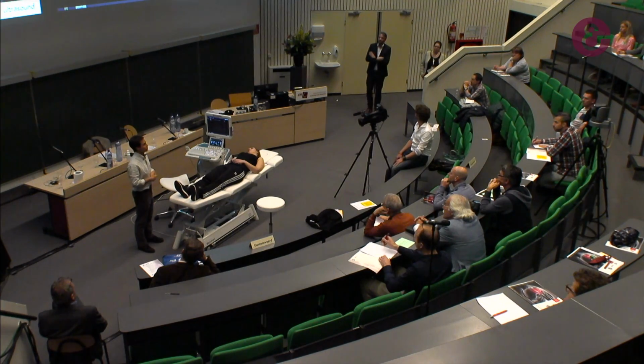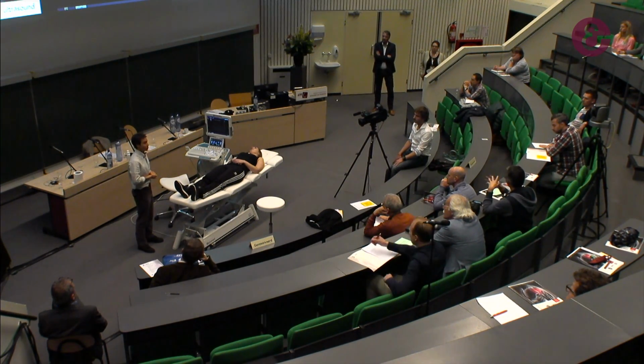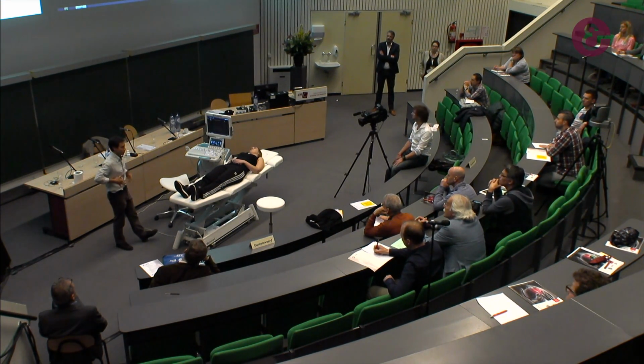So today I will speak about the use of ultrasound for the abdominal and the back region. I have decided to organize the presentation in two parts. One more focused on the anatomy, to recognize muscle and fascia, starting from the Linea Alba and moving to the back. And the second part will be focused more on how we can use the ultrasound in rehabilitation.